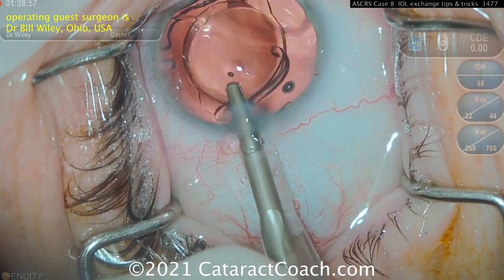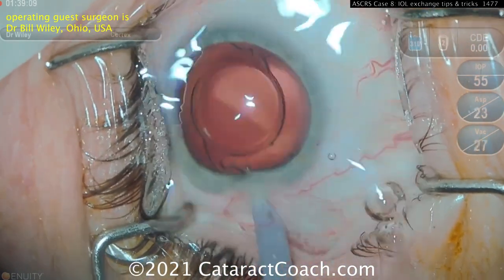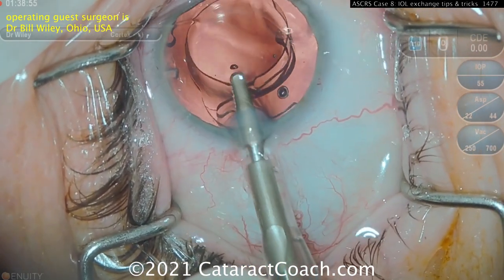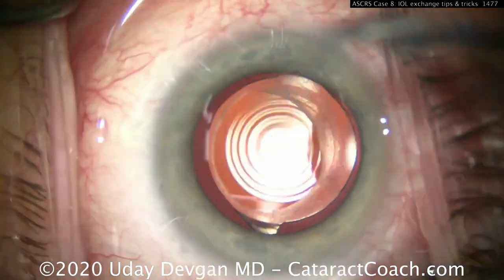Here it is again: the forceps are inside a cartridge — a typical lens injector cartridge — and you grab the lens and pull it out of the eye. You can un-inject: grab it and un-inject it. Now let's talk about how you free the lens from the capsular bag.